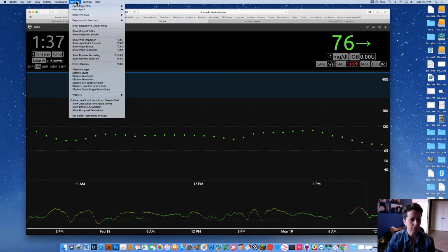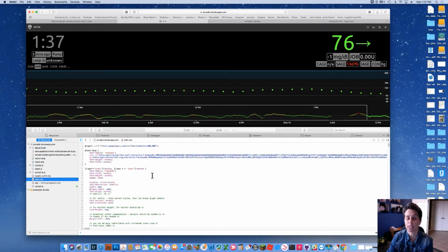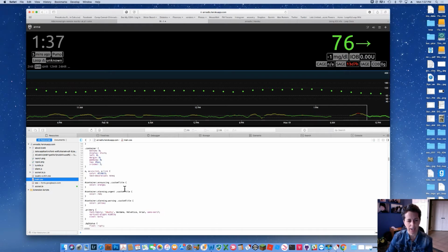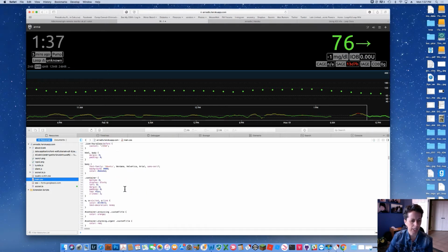Most of you probably don't use this very often, but most of your browsers will have some sort of developer tools. In Safari, it's under develop. You can go to show page source, and it opens up this panel on the bottom, which is kind of geeky, I get it. But one of the cool things is it allows you to play with the underlying code that creates the website you're viewing. And so a lot of times the colors are in there or the sizes of things are in there in this really funky way. And you can use this to actually live time change how your nightscout site looks and preview the changes. So for example, let's say we'll pick one here.